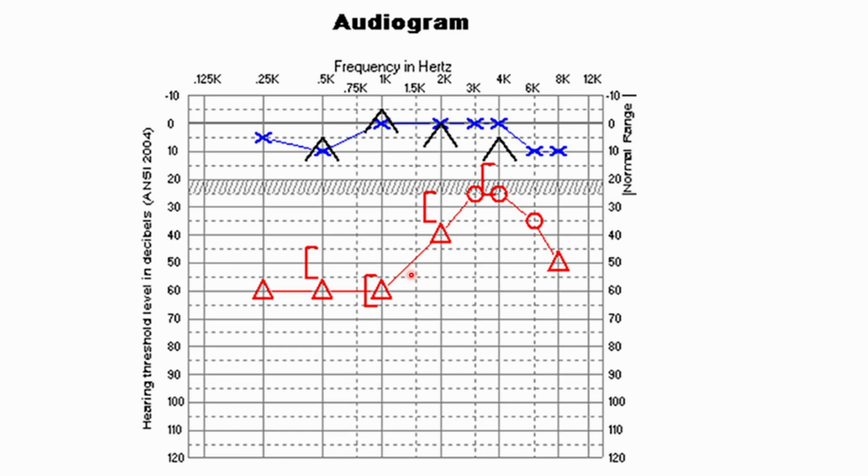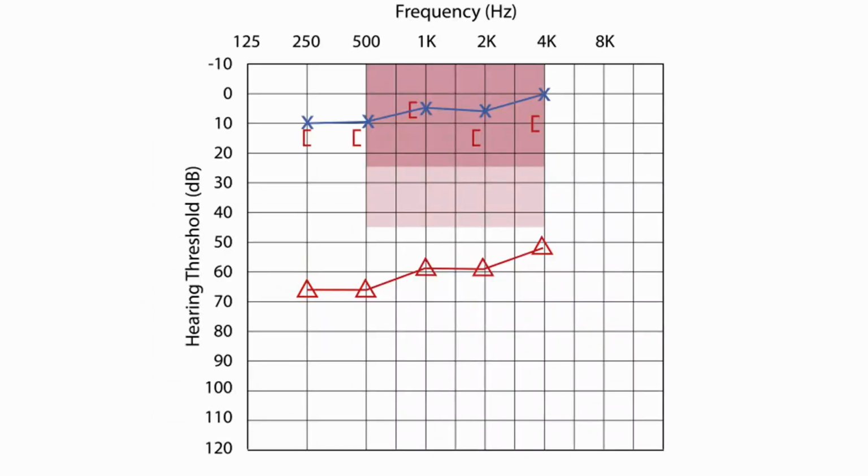So this question is also there, a patient with unilateral sensorineural hearing loss with tinnitus. The most likely diagnosis is Meniere's disease, acoustic neuroma, and the next investigation is MRI. So if this patient with this straight graph and none other symptom of Meniere's disease, then we may have to proceed with MRI to rule out the acoustic neuroma. So this another masking air conduction, but the gap is more than 15 decibels. So this is on one side of conductive hearing loss, and the left side is normal.